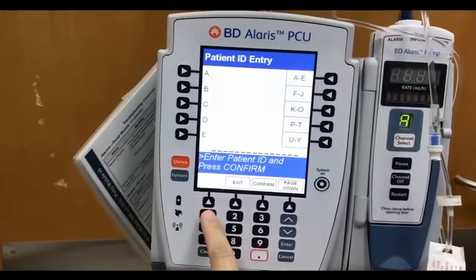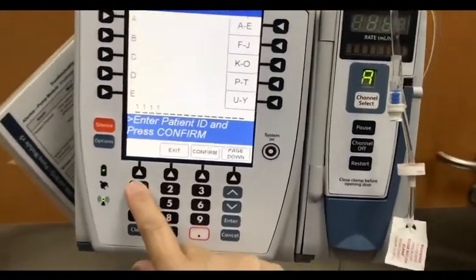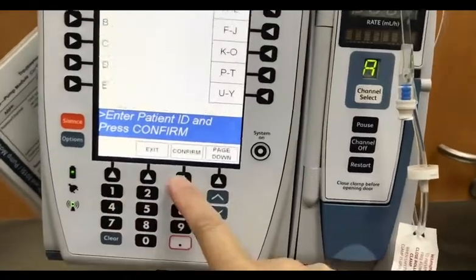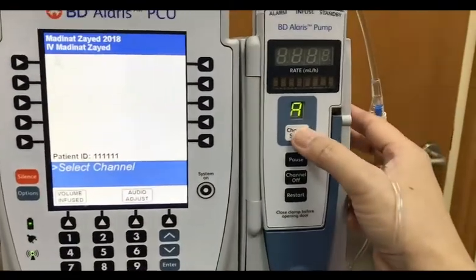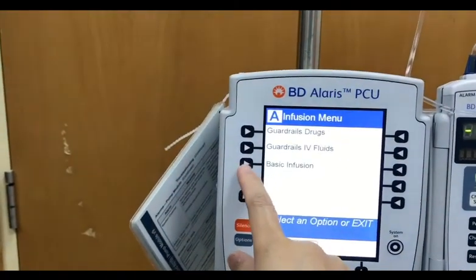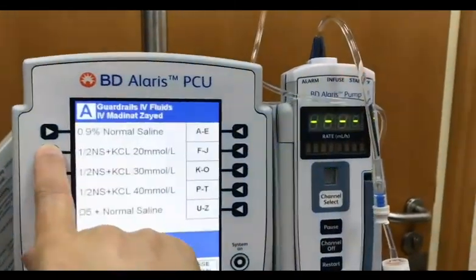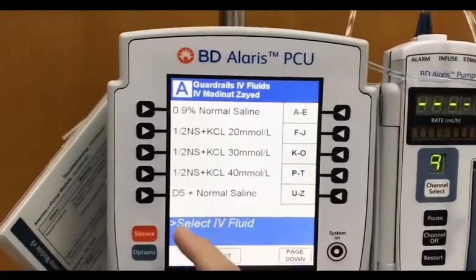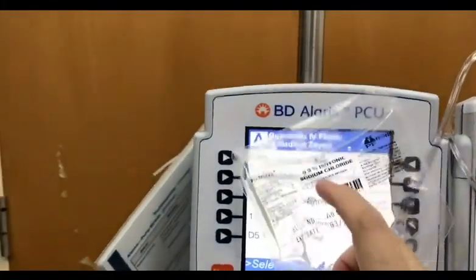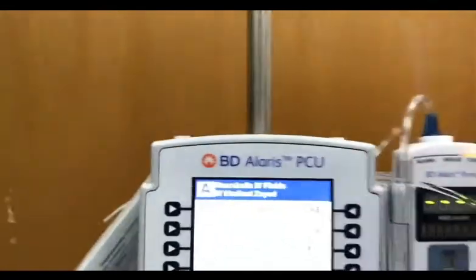I have the 6 numbers. 1, 2, 3, 4, 5, 6 digits now. Confirm. After entering the MRN, go to the channel select, either in the basic infusion or the guardrails IV fluids. If you go to the guardrails IV fluids, you will find here a lot of IV fluid names. Since this is normal saline, it says here sodium chloride. So this is my normal saline now.